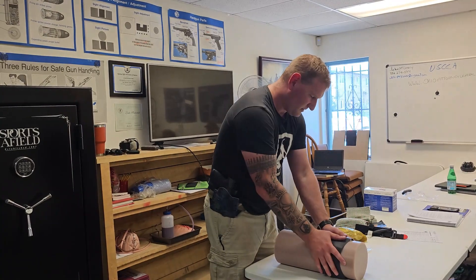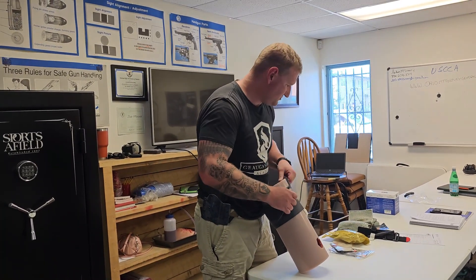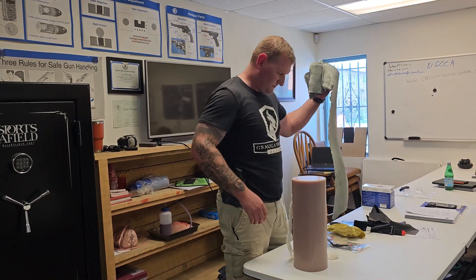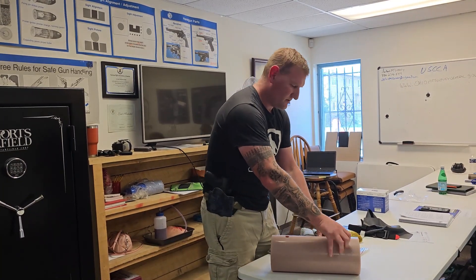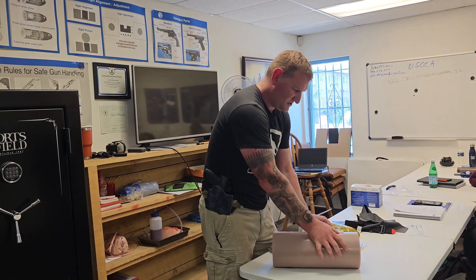We can still help, but that's another example. If we don't have the SWAT-T, we can also use an Israeli bandage as well. Check this out — if I really pack all this in, I want you to see how much packing material fits — you're going to be shocked.